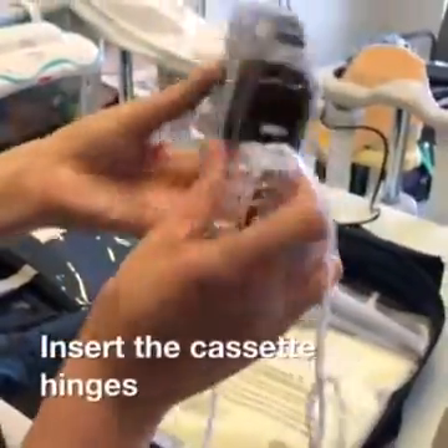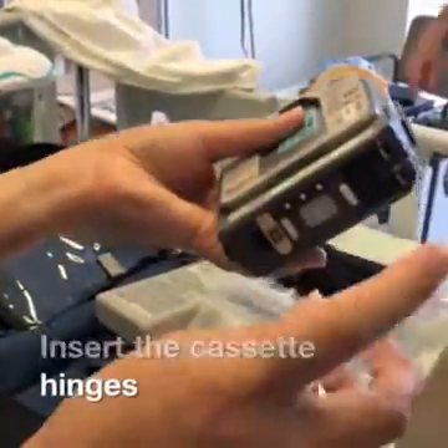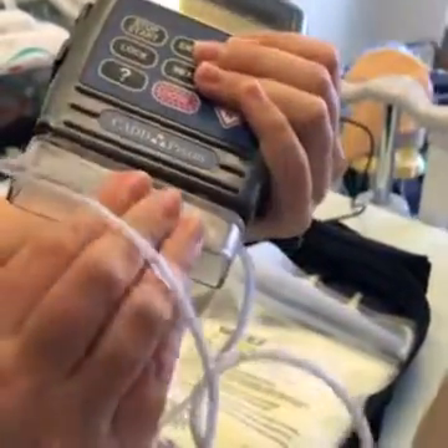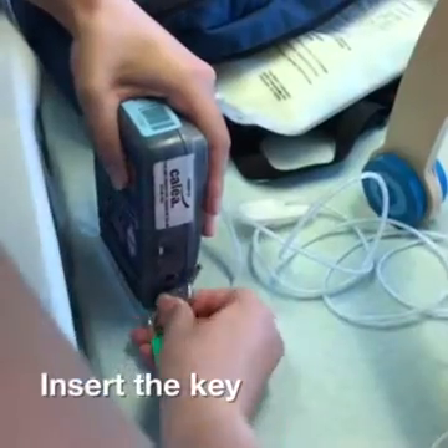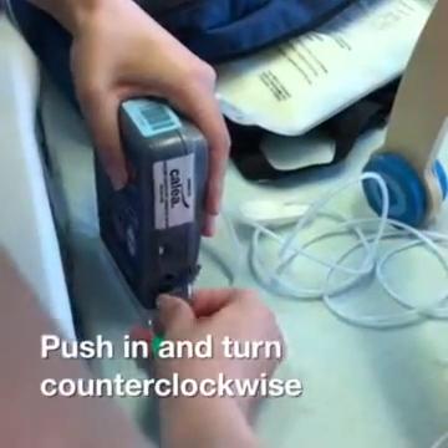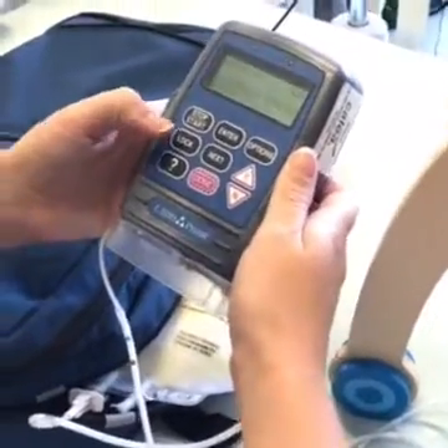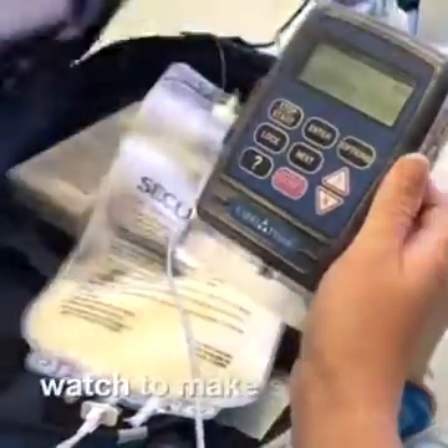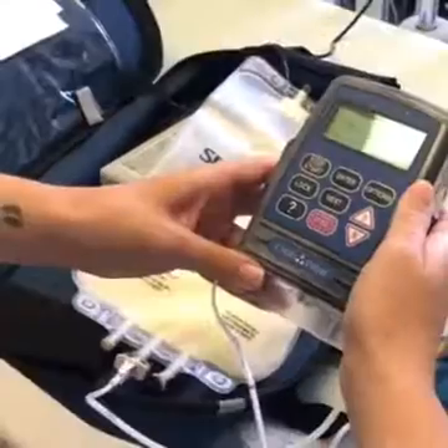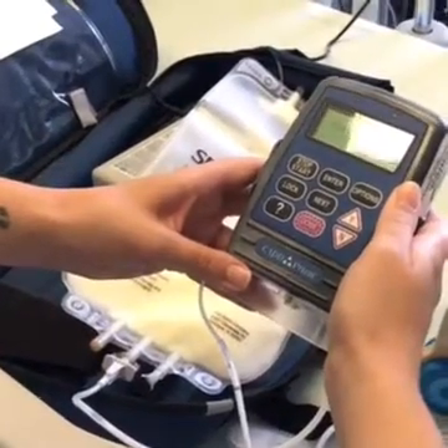Insert the cassette hinges into the hinge pins on the pump, then insert the key into the slot on the side of the pump. Push in and turn counterclockwise until the slot lines up with the dot at 12 o'clock. While the pump reviews the information you've entered, watch to make sure it was entered correctly. PN will start infusing once the review is complete.